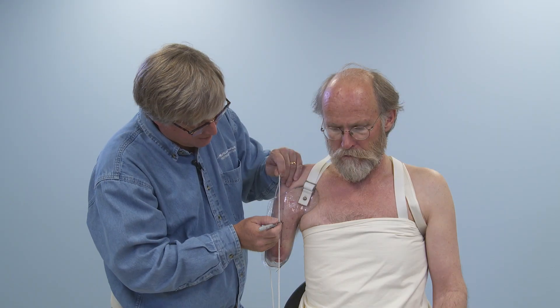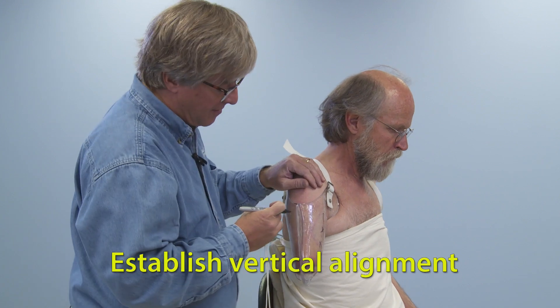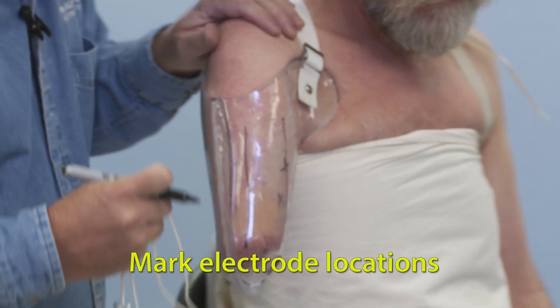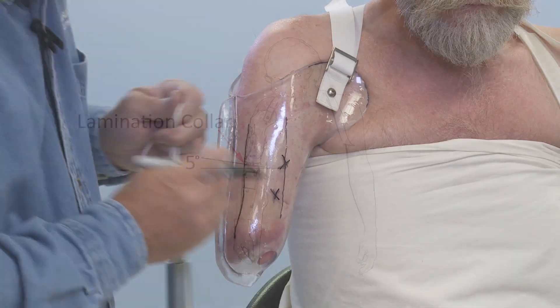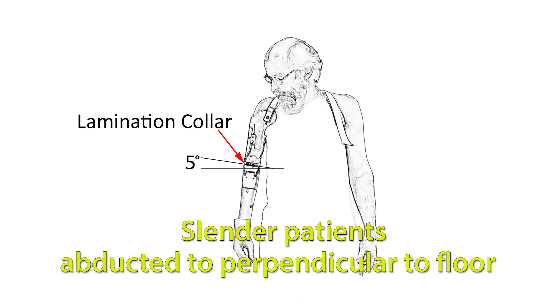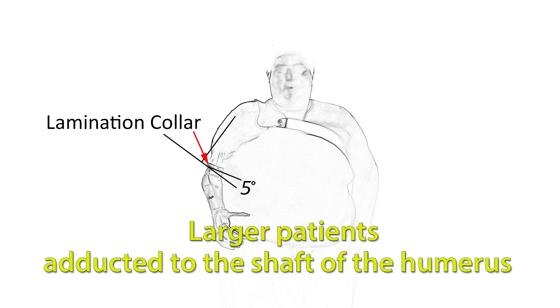Attach the harness and use a plumb bob to establish vertical alignment of the socket in both frontal and sagittal planes. Mark the electrode locations on the evaluation socket. Attach the adjustable lamination collar, slightly flexed from vertical. With slender patients, the lamination collar will be abducted slightly to perpendicular to the floor. For larger patients, the lamination collar will be slightly adducted to the shaft of the humerus.